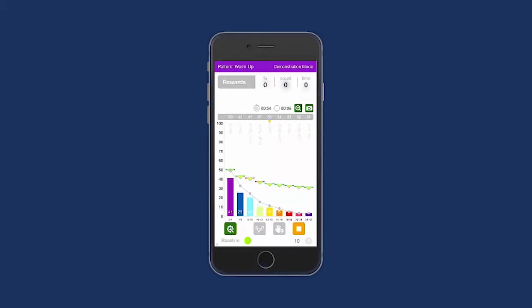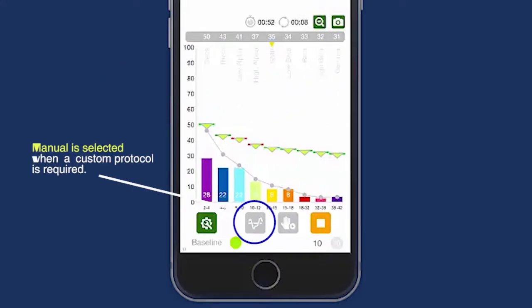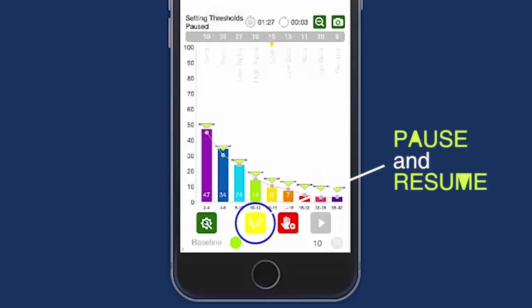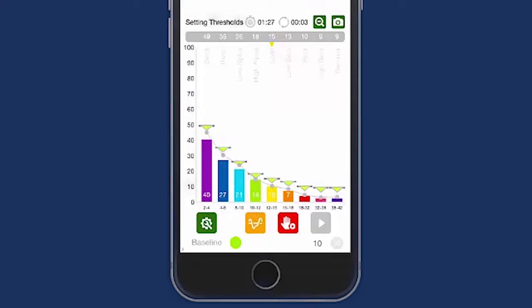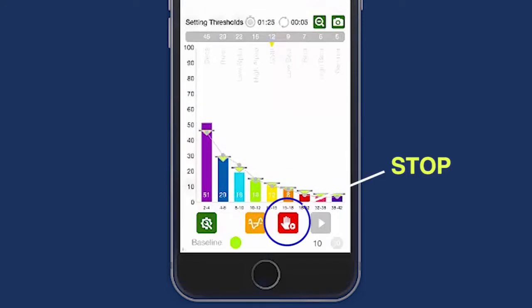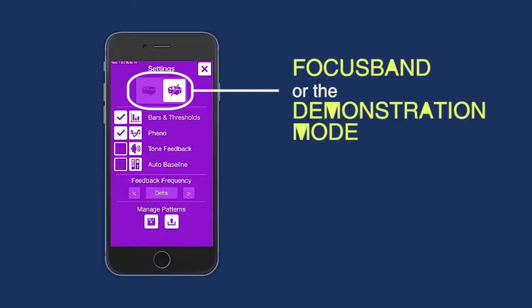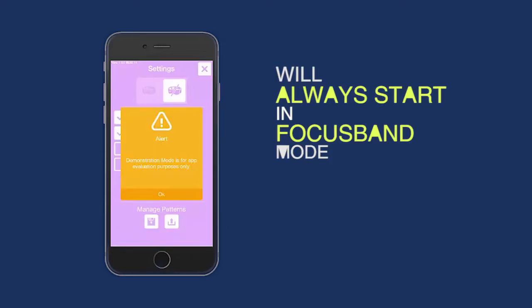Manual is selected when a custom protocol is required. Press the pause and resume keys at any time to check the threshold levels, then press stop at any time and start the training with the derived thresholds. Fino derives the user's current brain map settings.